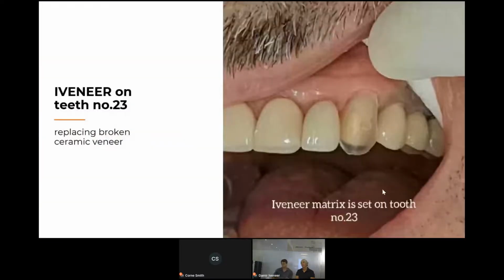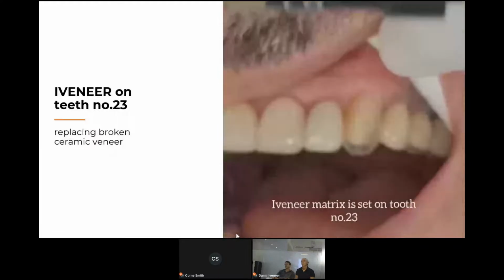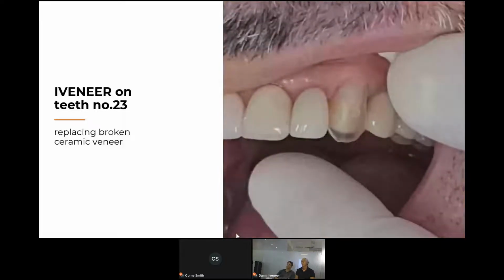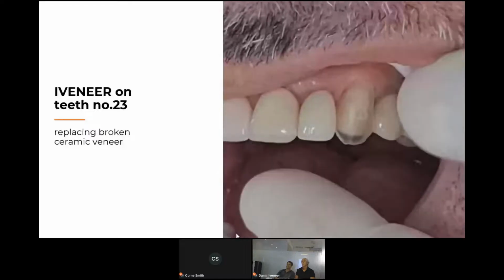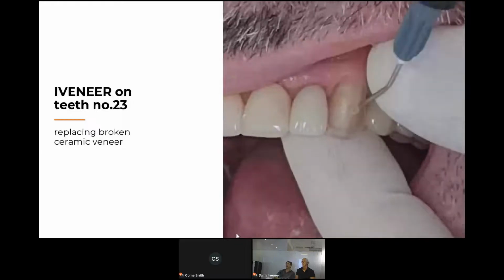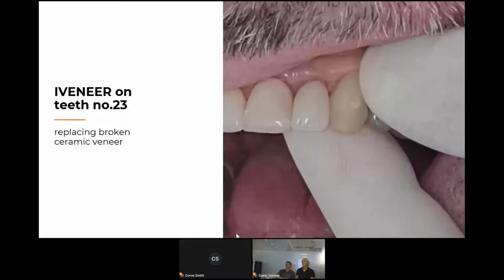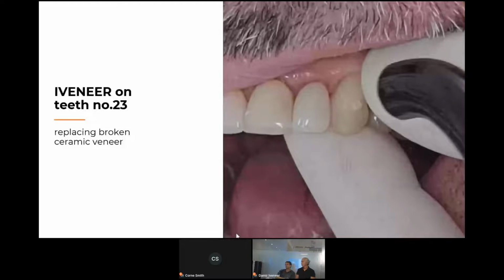So here I want to show you another clinical case. In my opinion, these teeth, number 13 and 23, the canines, are the most simple teeth to do. All you have to do is put the matrix and make sure it's in place. In this case, this is another technique for doing a palatal shell only with my finger. I block with my index finger, I put my thumb on the cervical area to hold it, and push the flowable material inside, and then I cure it.